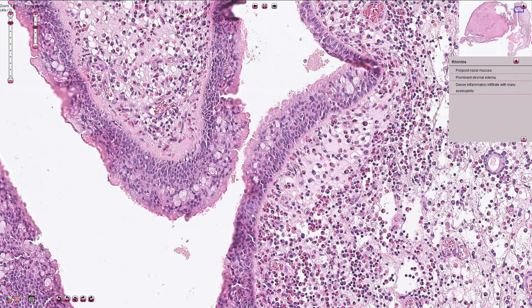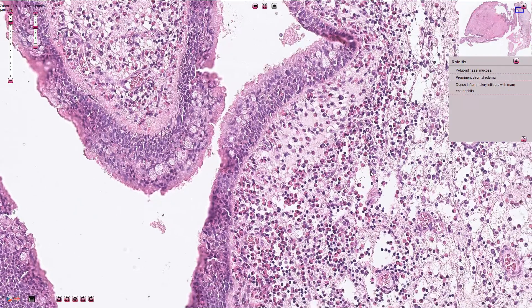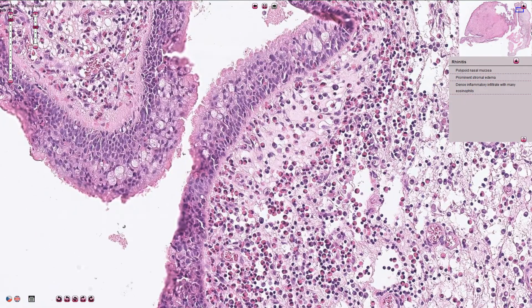The inflammation is commonly associated with a thickening of the basement membrane, which can be seen here. The stroma is edematous and we see many chronic inflammatory cells.